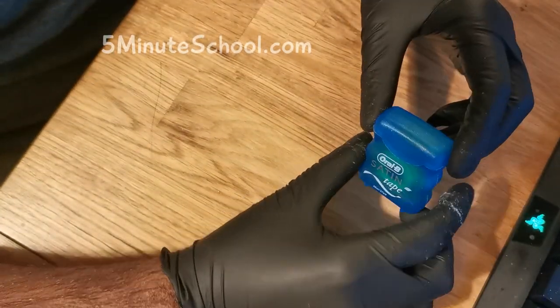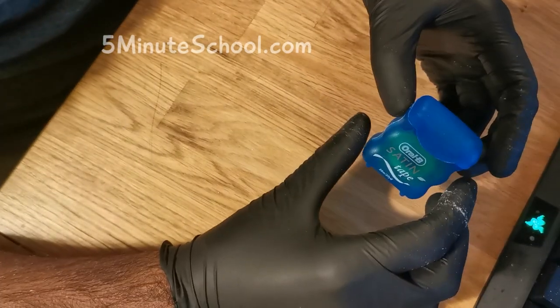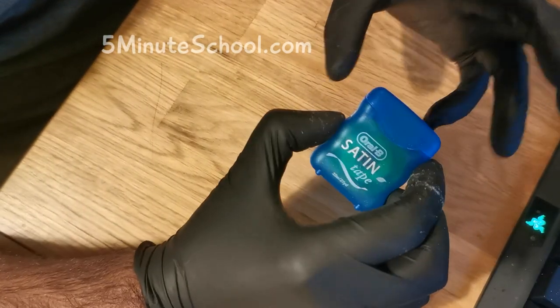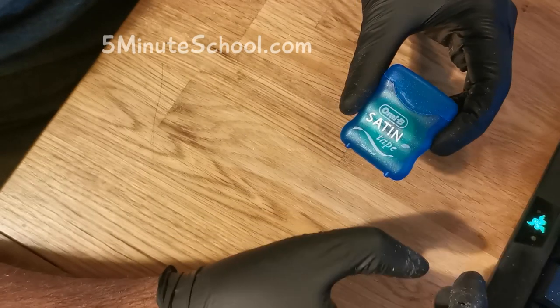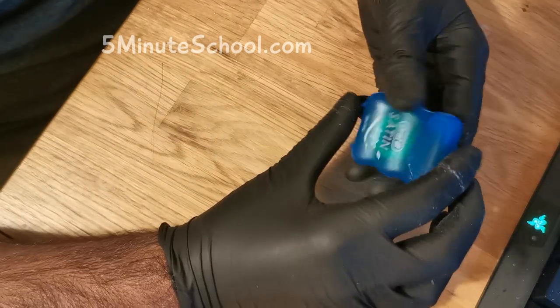In this video I'm going to teach you guys how to tie a floss ligature. This is a really good way of securing your rubber dam in position. You just tie it around the tooth and it prevents the rubber dam from moving up, so it keeps the rubber dam in position.